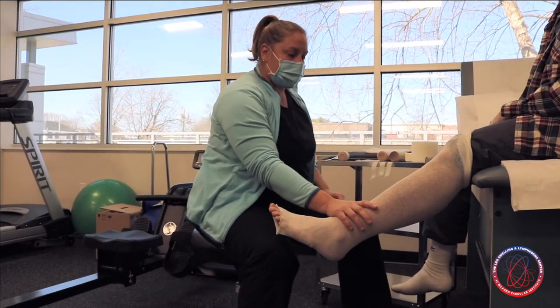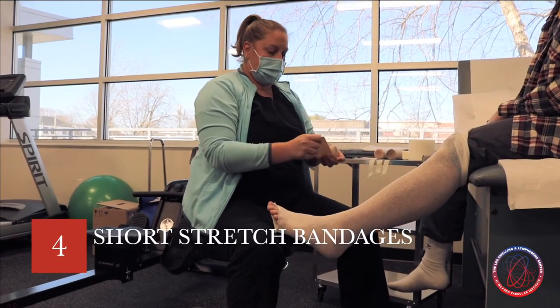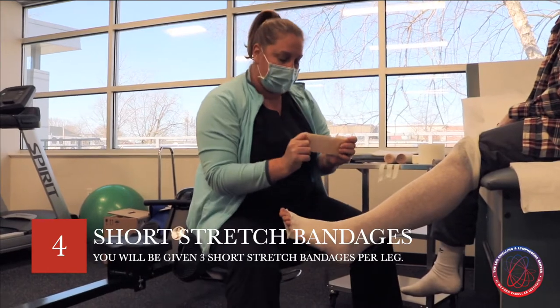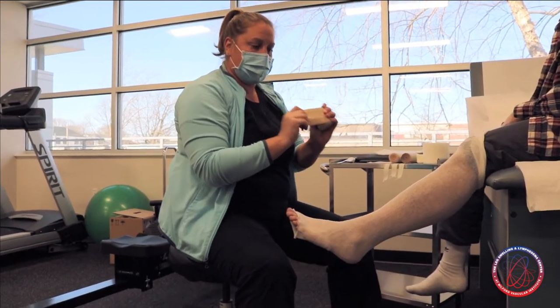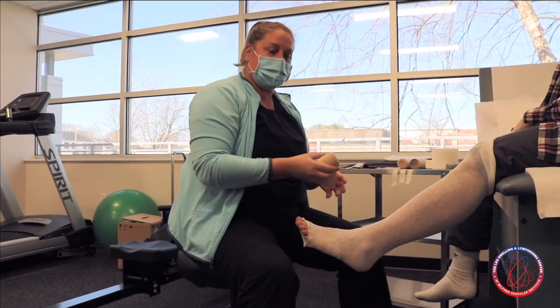Today we're going to focus just on how to apply the short stretch bandage. A short stretch bandage is exactly what it sounds like — it's a bandage that does not stretch much, and we use this because it provides a lot of containment so it does not allow your leg swelling to fluctuate.